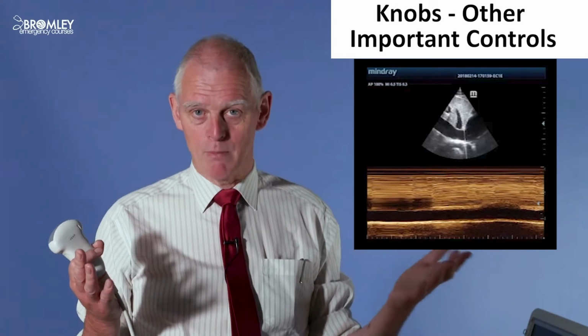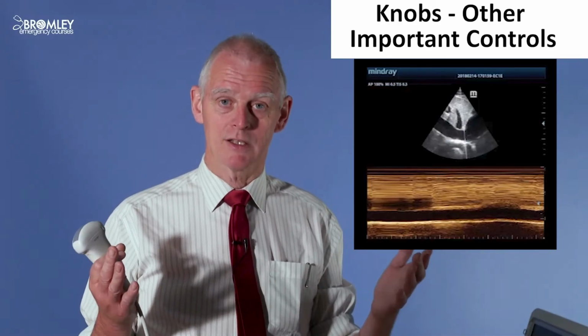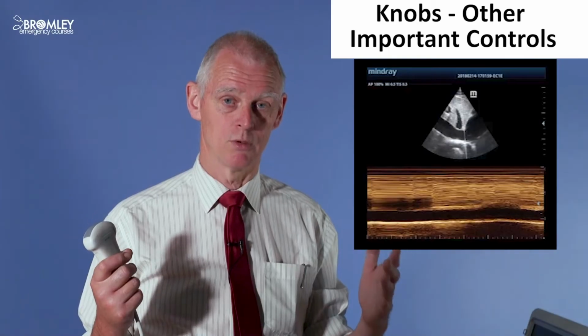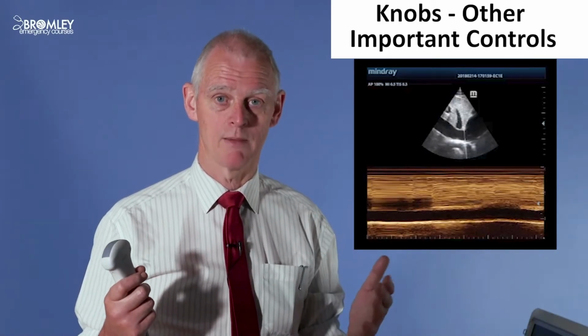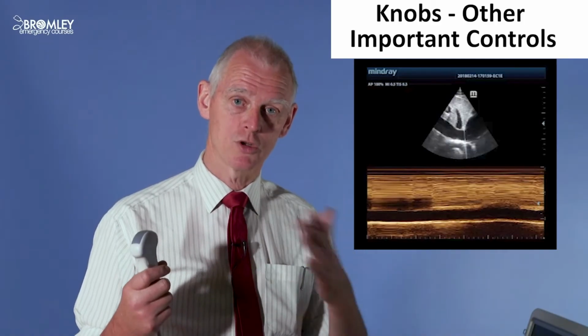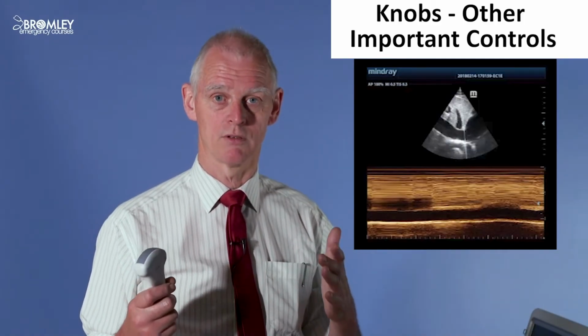It's called B mode. Now, it's a bit of an archaic term, but we're sort of stuck with it, and that's B mode, brightness mode ultrasound, so two-dimensional images. So that's what we are used to when we think about cross-sectional anatomy with ultrasound.